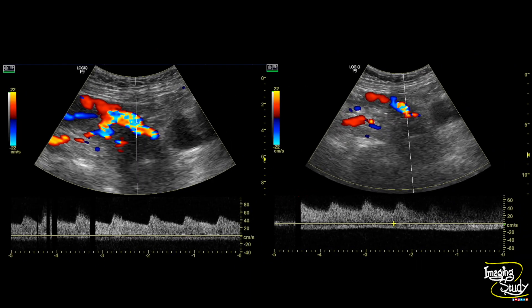Here is another picture. On the right image we have taken a sample from the left uterine artery, which is dilated and tortuous, showing low-impedance flow similar to the right one. On the left image, the sample from the tornado vessel again shows low-impedance flow.